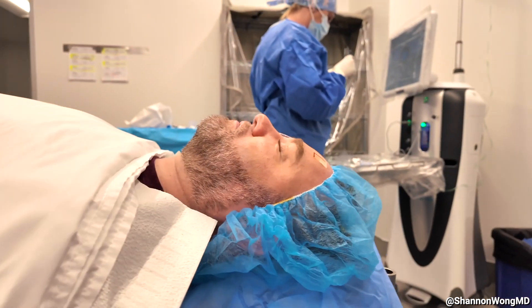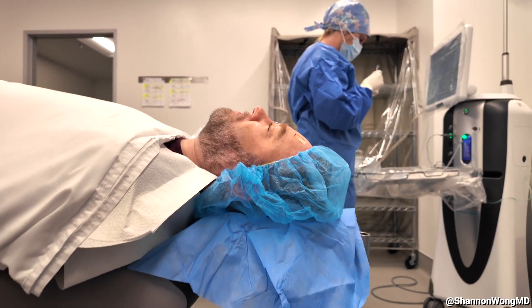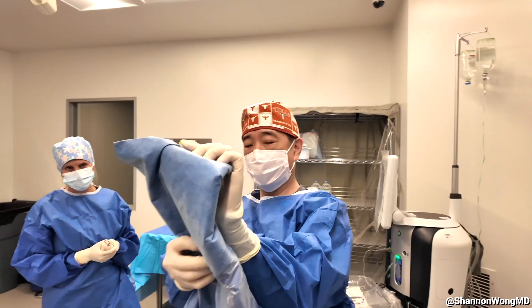Before we apply the drape, we make sure our patient is in an optimal position where the infraorbital and superorbital rims are parallel to the floor. Then we fold our drape in half.